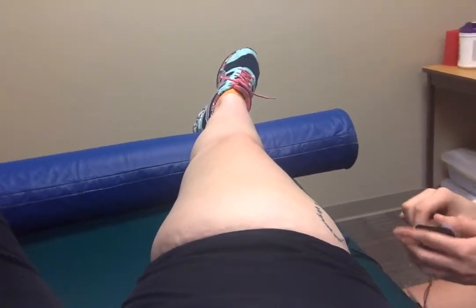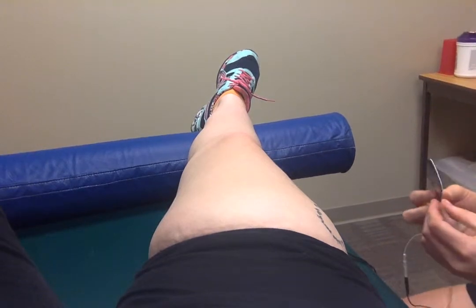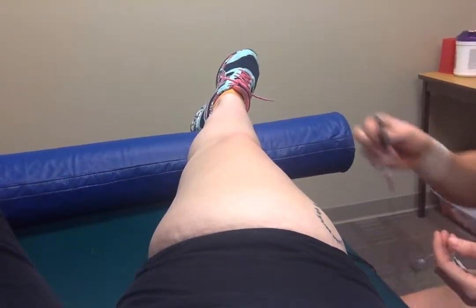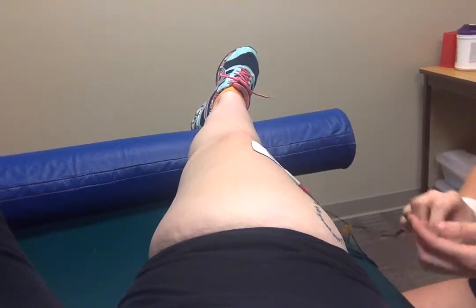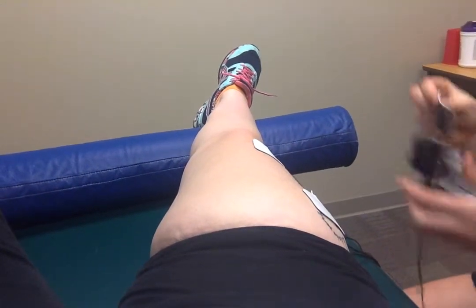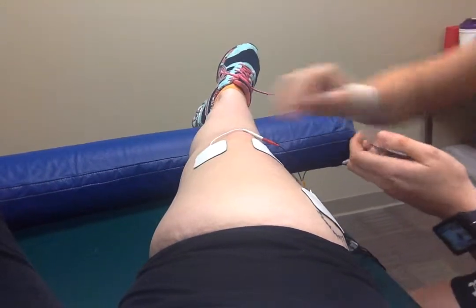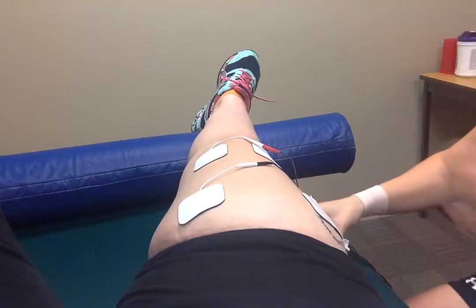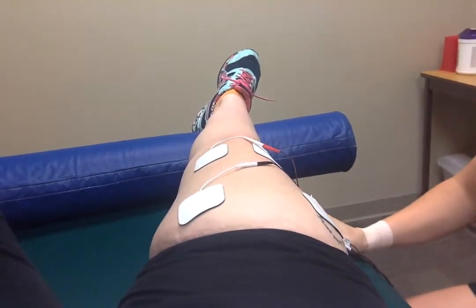What we would do is set the patient up, have them laying down with a support at the ankle, and we're going to place electrodes over the vastus lateralis and medialis — basically the VMO — and place that here.